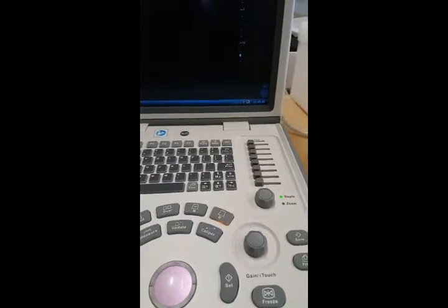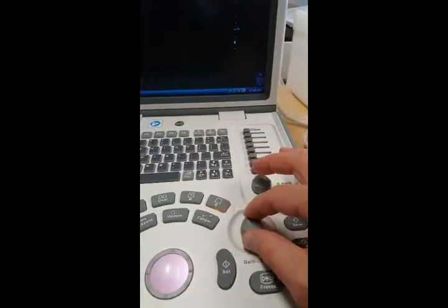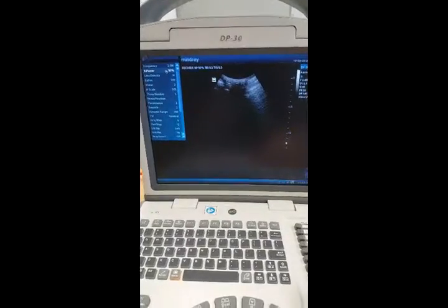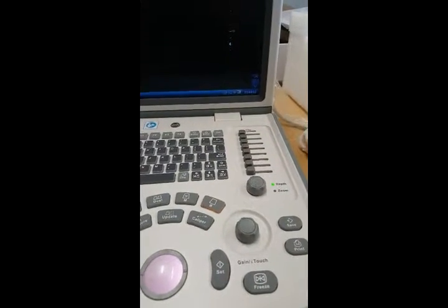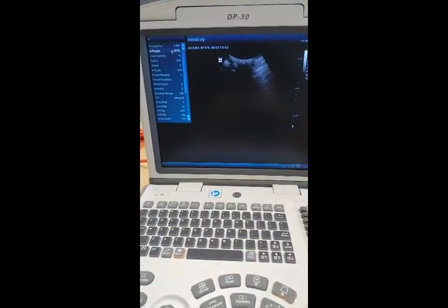To adjust the gain, we use the gain touch here, and you can just rotate left and right, and you'll see it makes it more white or less white. So really these buttons will generally adjust just the contrast and the gain of the image to adjust it to the user's preference.